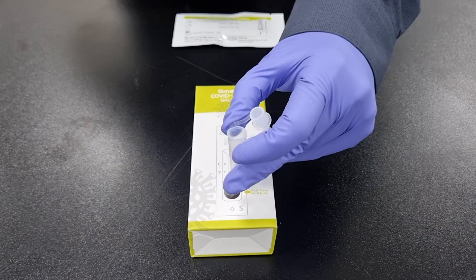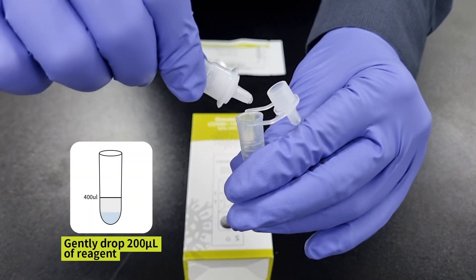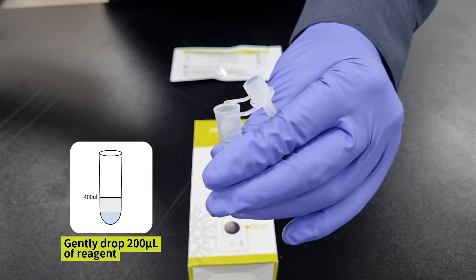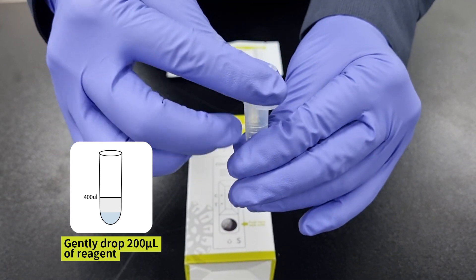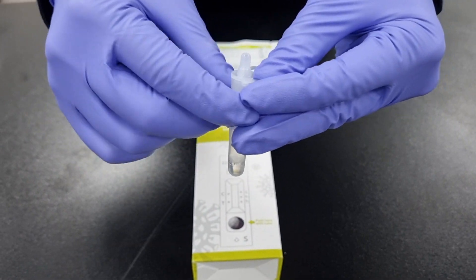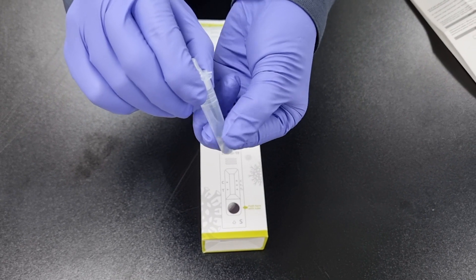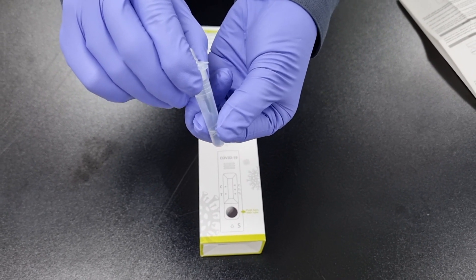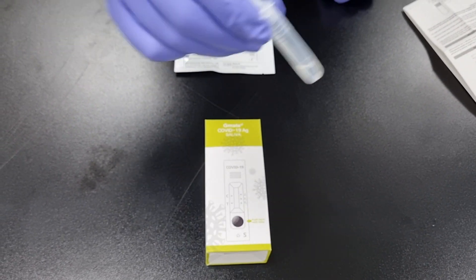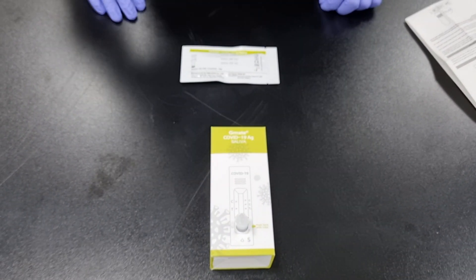Step 8: Gently drop the reagent into the sample collection tube until it reaches the upper line of the sample collection tube, then close the sample collection tube with the attached dropper cap. Step 9: Squeeze the lower part of the sample collection tube 20 times and gently swing it side to side 20 times. Return the sample collection tube to the hole of the package box.